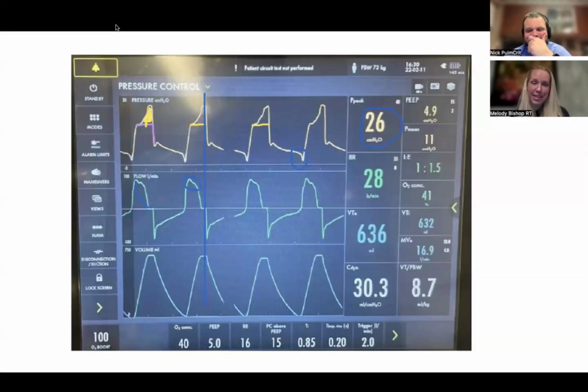To be honest, out of the control modes, it's hard to say, because of the four variables we talked about at the very beginning, pressure, volume, flow, or time, I feel like there are essentially equivalencies between pressure control and volume control. With PRVC, trying to do things ends up worsening the situation, and the patient doesn't have control over volume or pressure because the vent is driving. So I feel like PRVC is a lot less free.